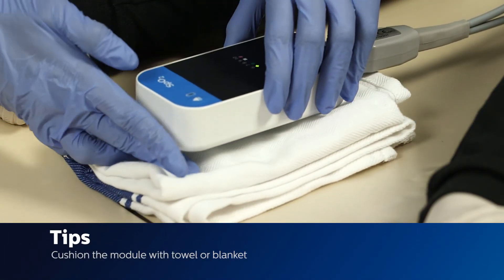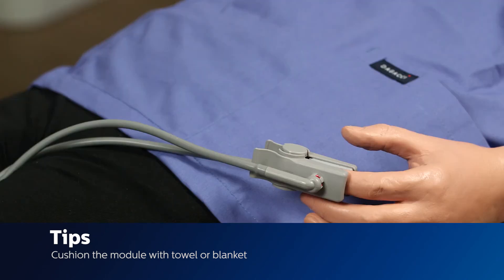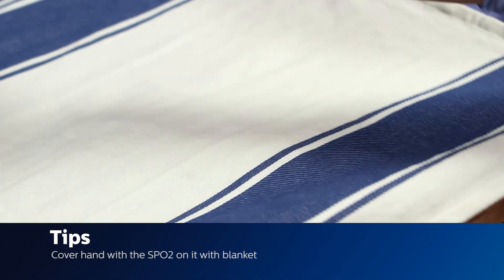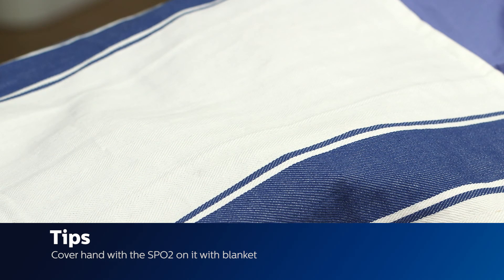Place the module on a cushioned surface such as a blanket or towel to minimize MR vibrations. Cover the hand that has the SpO2 on it with an opaque blanket to keep ambient light from affecting the reading.